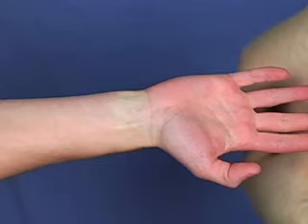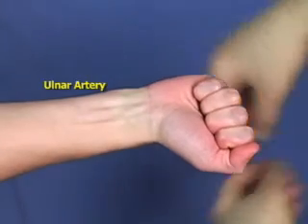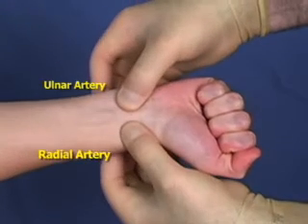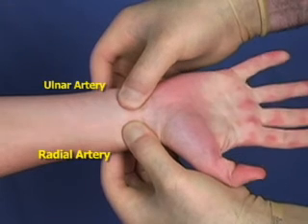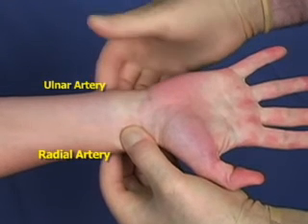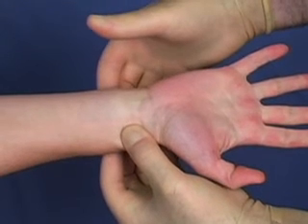In the Allen test, the operator occludes both the ulnar and radial pulses while the patient tightly clenches their fist. The hand is then opened and pressure on the ulnar artery is released.